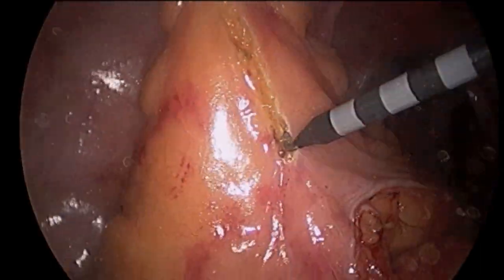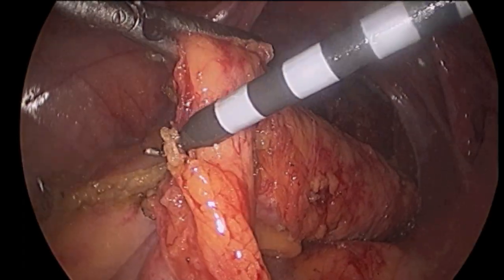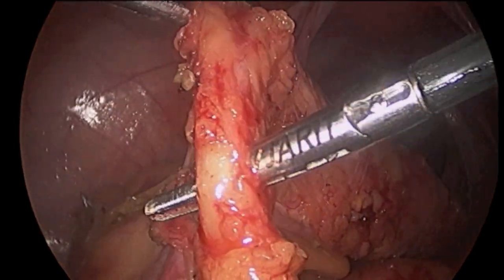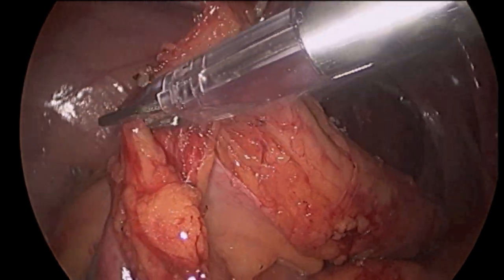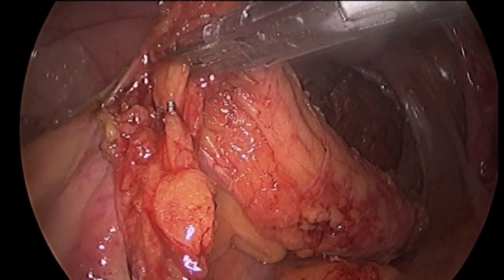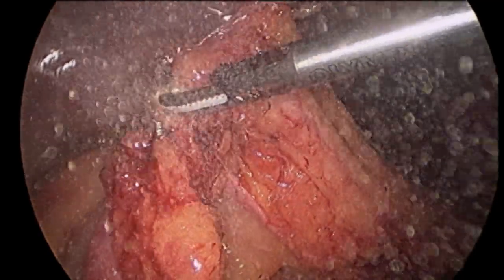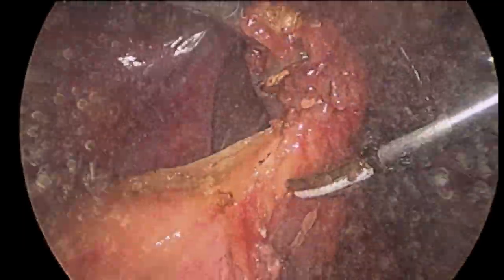The mesentery is scored to mark the line of transection. Next, the large arteries and veins to this bowel segment are individually dissected out, carefully clipped, and then divided with the ultrasonic scissors. Small blood vessels near the bowel can be divided with the ultrasonic scissors alone.